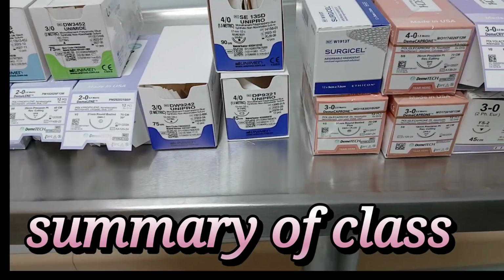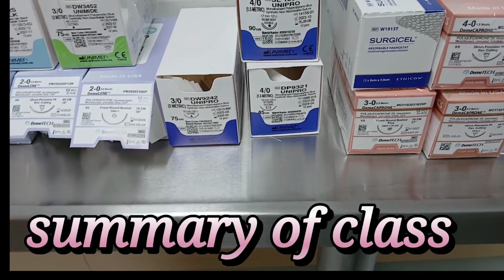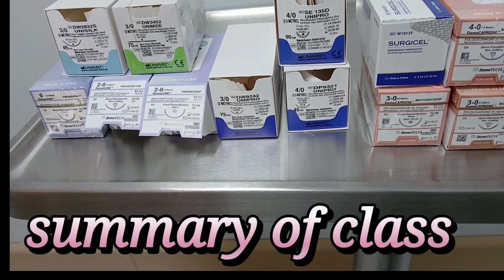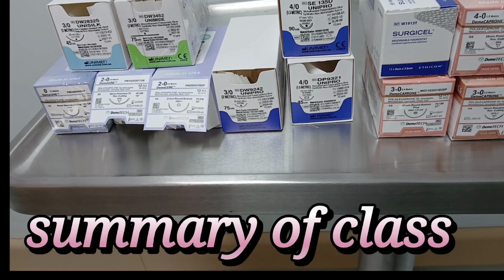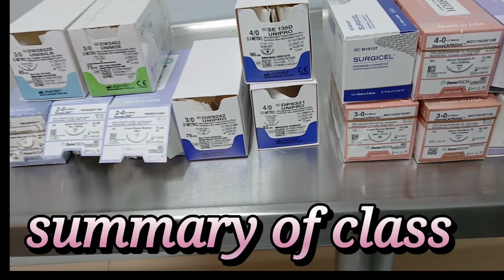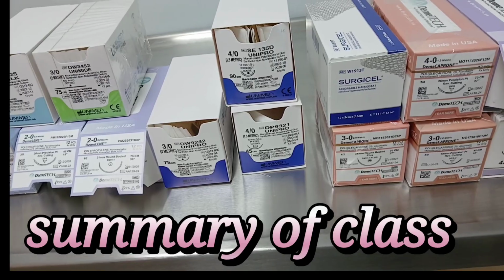Then I explained what suture materials are available here. According to the color also we can differentiate the suture material. Then I explained absorbable suture and non-absorbable suture. We receive the suture material from three sources: natural, synthetic, and steel. And lastly I explained how to differentiate round body and cutting needles.